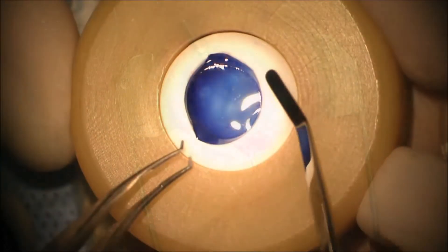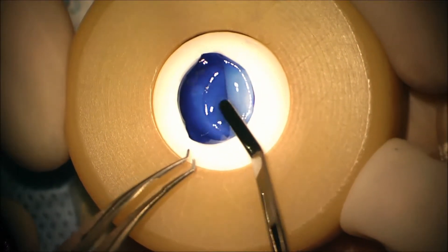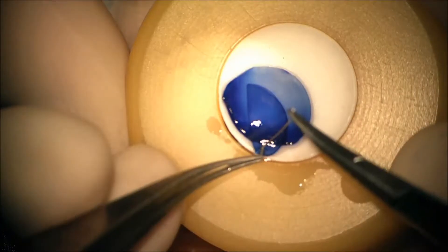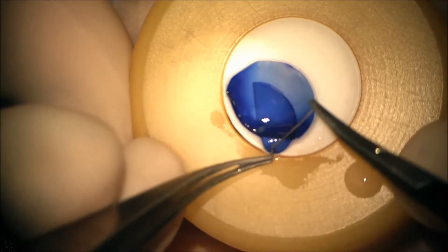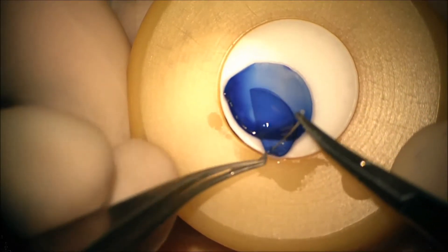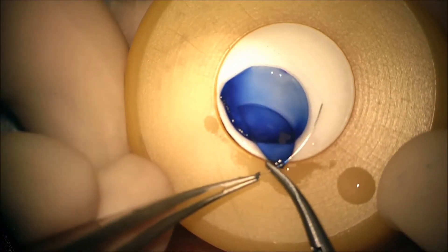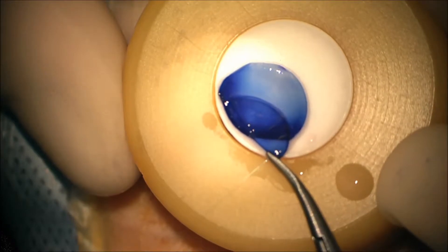Here we make a main wound temporally and extend it. Here's folding the DSEK graft — what we do is using a CTC6 10-O prolene needle, we pass suture partial thickness through the end of the graft as shown.